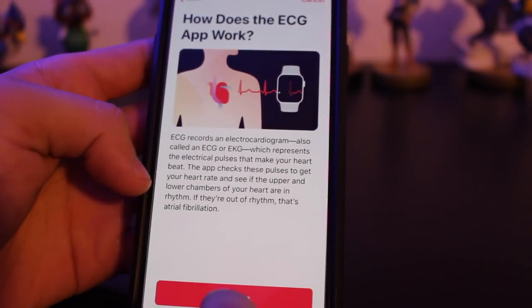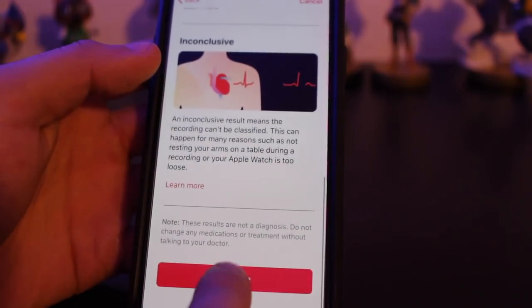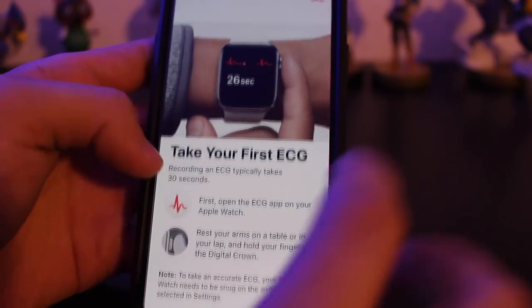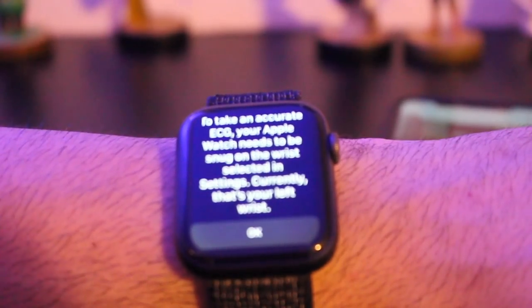Once you do all that, there's a bunch of disclaimers that Apple is gonna tell you — like don't rely on the Apple Watch, it's not a real medical doctor, if you're experiencing pain seek medical help ASAP, talk to your doctor, don't rely on the Apple Watch. That's all they're really telling you. But once you complete this process, you can then go back to your Apple Watch and relaunch that ECG app and this menu will pop up.